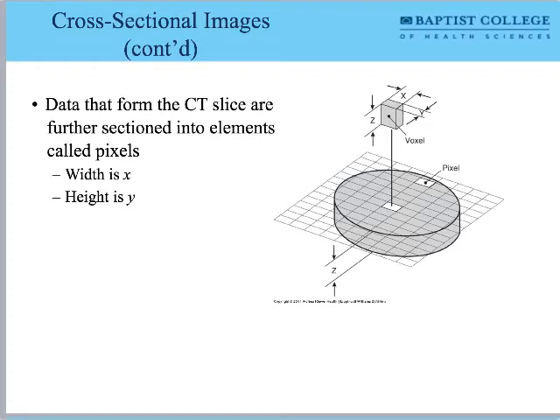The width is the x-axis and the height is the y. So if you're looking at the picture, and you're scanning from left to right on the CT image, just one slice on a CT image, that x-axis is basically left to right on the patient's body, if they're laying on their back on this CT table, and the y-axis would be up and down, just like with a normal Cartesian graph, like what we did in trigonometry and geometry. It's the same x and y-axis. But now we're saying those are locations in the patient's body.